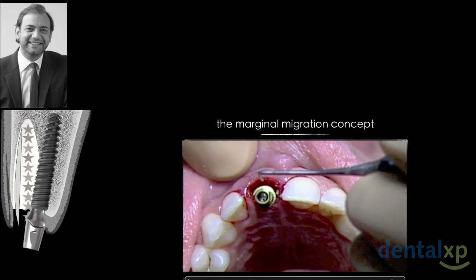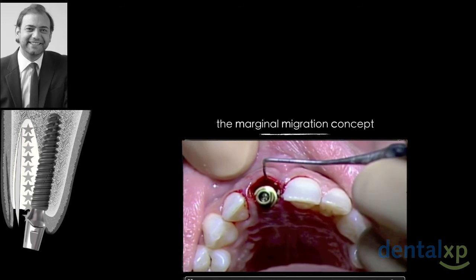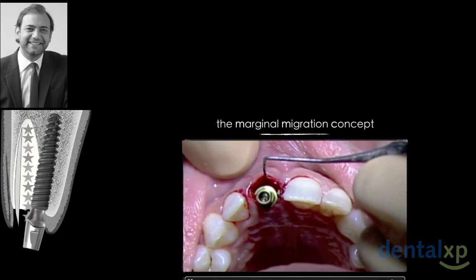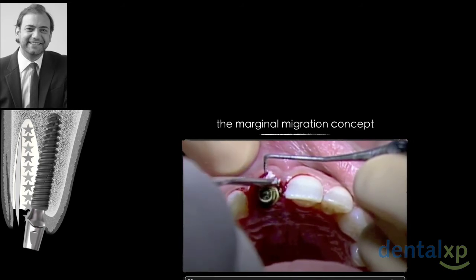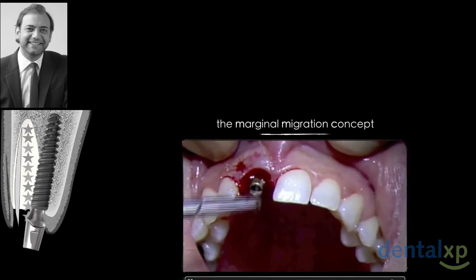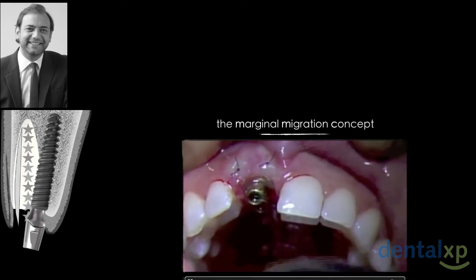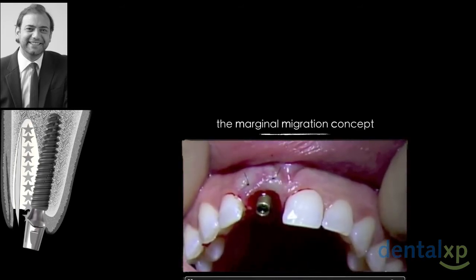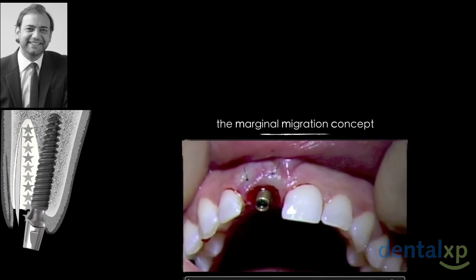And we will see this is very important to do. So after we do so, our assistant will hold the membrane in place and we will graft with a slow resorbable material, as you see here. After doing so, we will place two positioning mattress sutures, a little bit more centered and more apical, 1 to 2 millimeters to our margin. We would like to seal the area here.